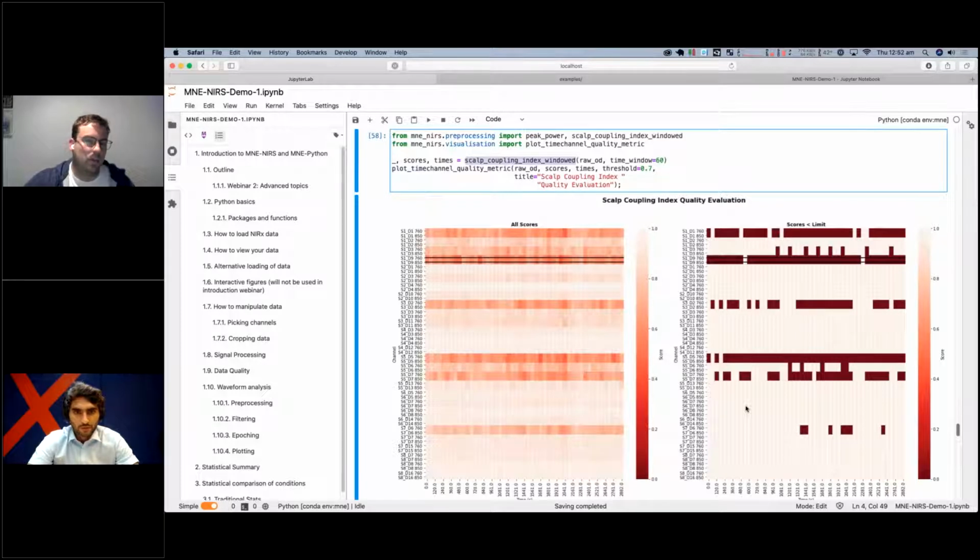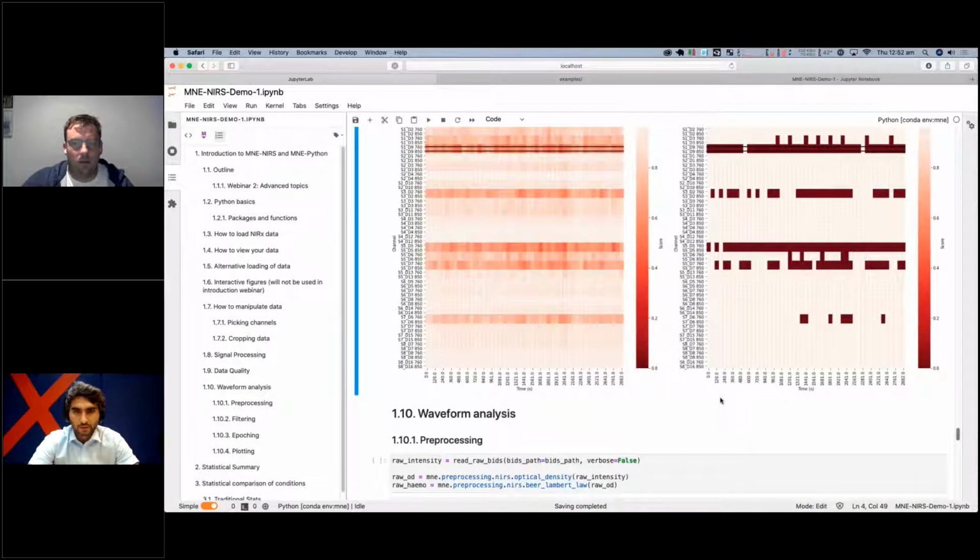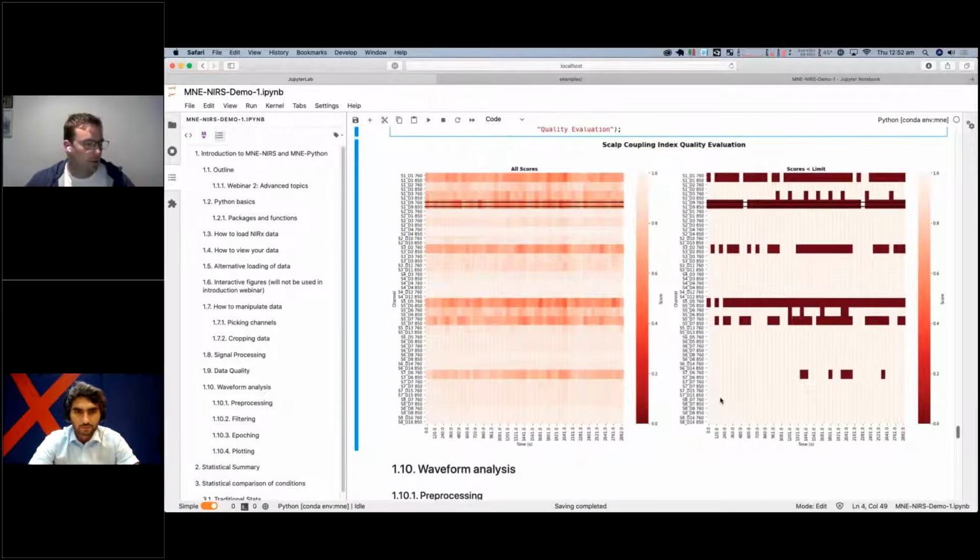Mm-hmm. I'm sorry to interrupt again. We have a couple of questions on the Beer-Lambert law, if you would like to take them now. Yeah, let's do it now, while I have a drink of water. Basically, how much control do we have over the parameters we define, DPF, etc., and can we change them? Yep. The distance is calculated from the 3D locations of the sources and the detectors.